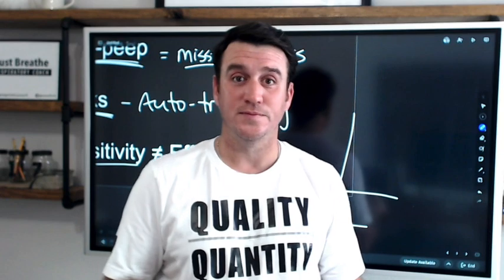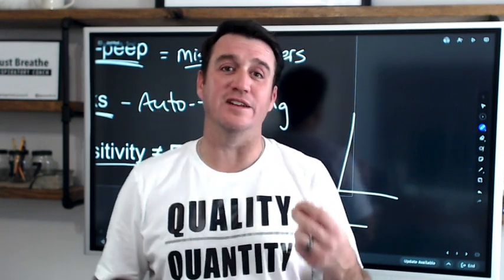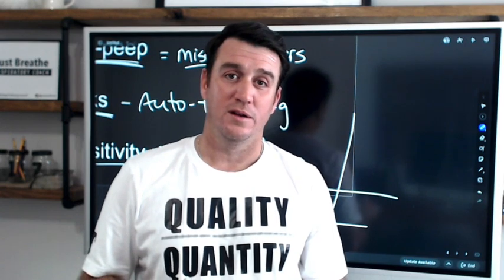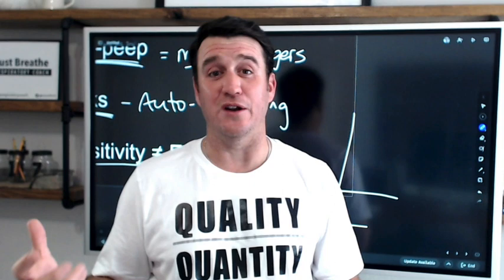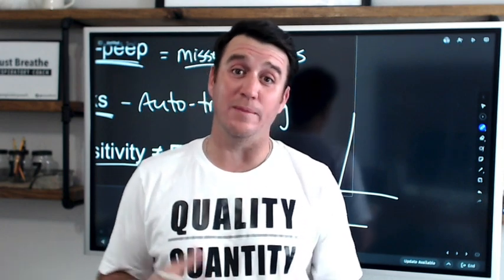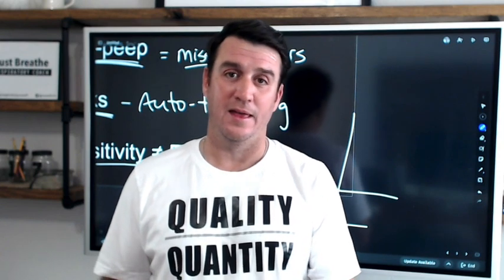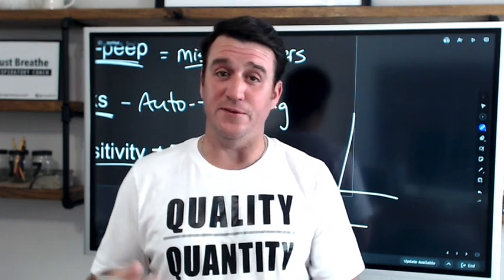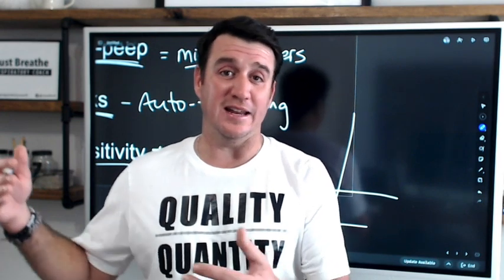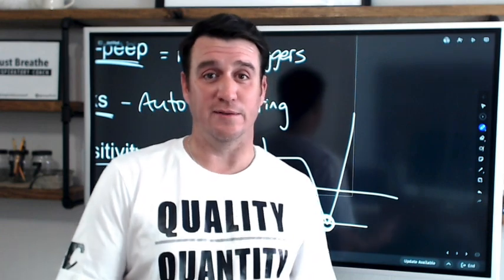And that's true. But it did not solve that patient's neural drive and desire to breathe. So understand that if you have a patient who is triggering an excessive amount of volumes and maybe they're hyperventilating, there's probably a reason they are hyperventilating. Maybe they're a head injury or a neuro patient. Maybe they're trying to compensate for metabolic acidosis. For whatever reason, if a patient is trying to take an excessive amount of breaths, most likely there is a reason for it. Maybe our sedation levels are not correct.